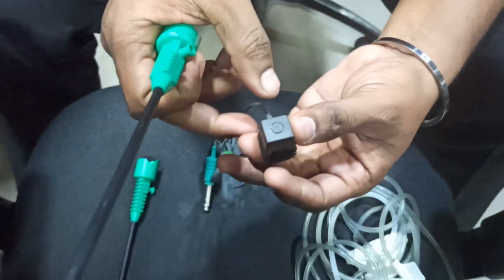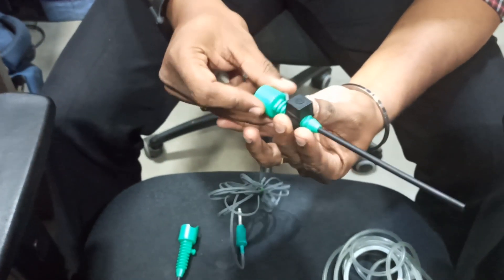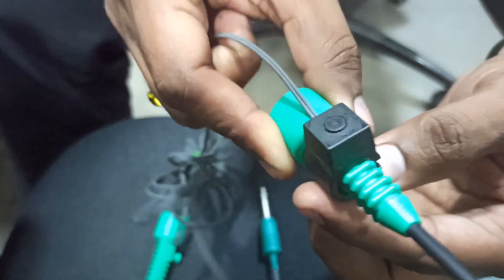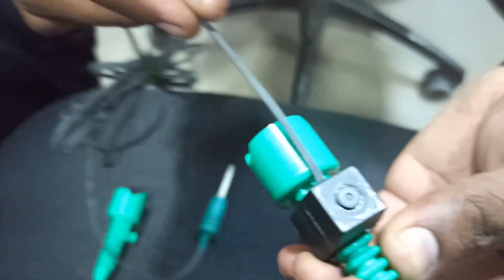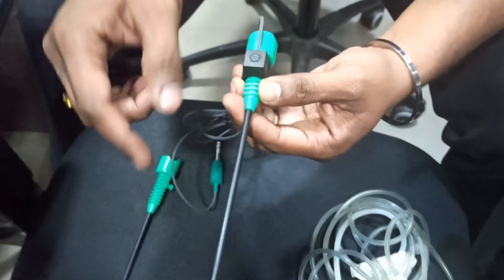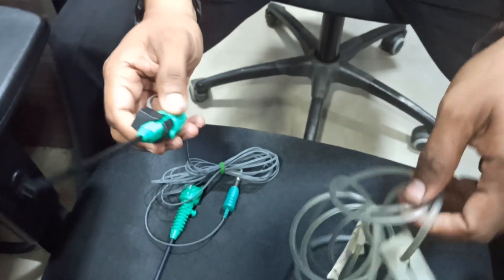To set up: take the rotation so the wire is on the surgeon's side. Then insert it here — once you insert it, this screw will get locked. The cutting edge will be locked here. The wire has to go to the surgeon's side; it is not supposed to be in the opposite direction, because this is the sterile field area.